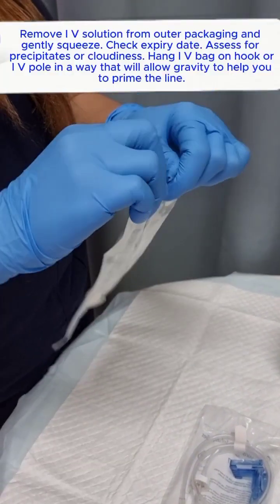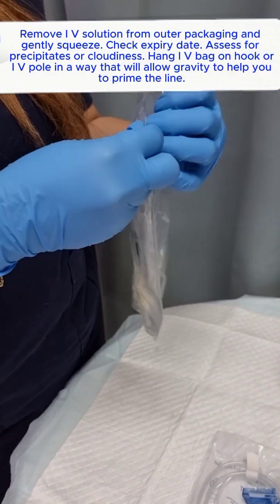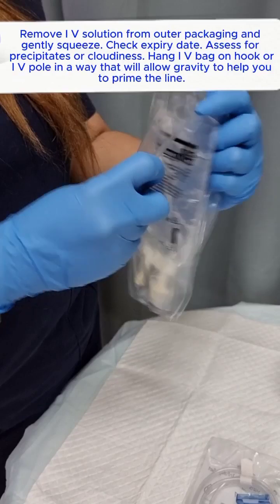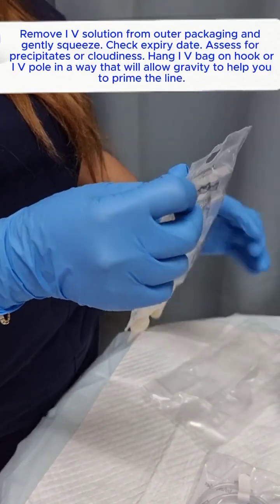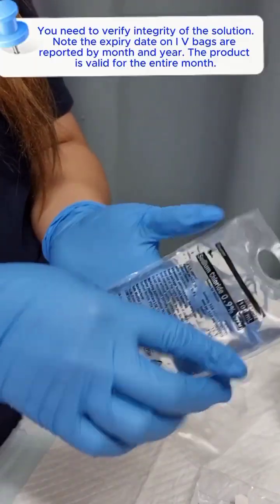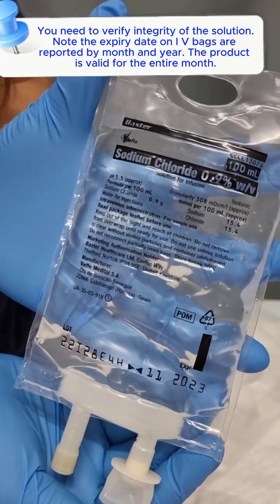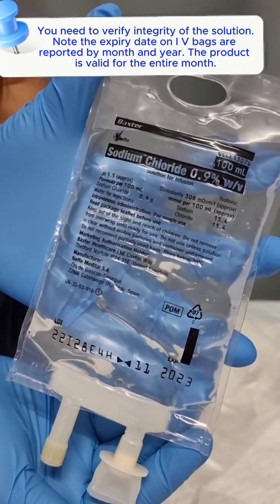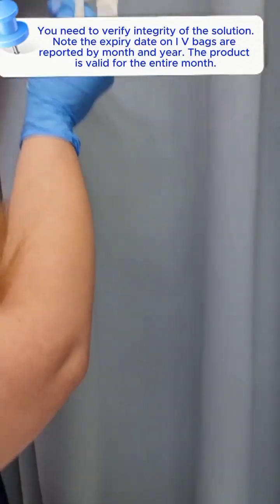Remove IV solution from outer packaging and gently squeeze. Check the expiry date and assess for precipitates or cloudiness. Hang the IV bag on a hook or IV pole in a way that will allow gravity to help you prime the line. You need to verify integrity of the solution. Note that expiry dates on IV bags are reported by month and year, and the product is valid for the entire month.